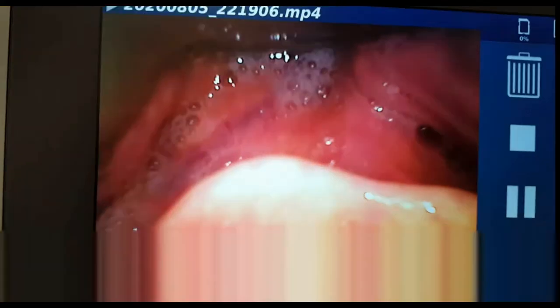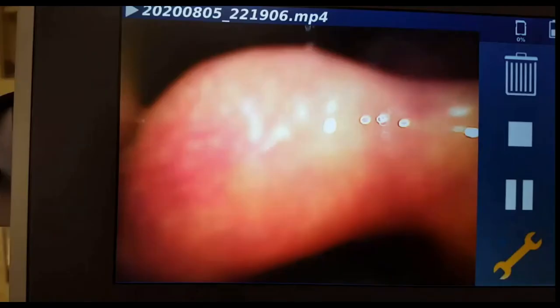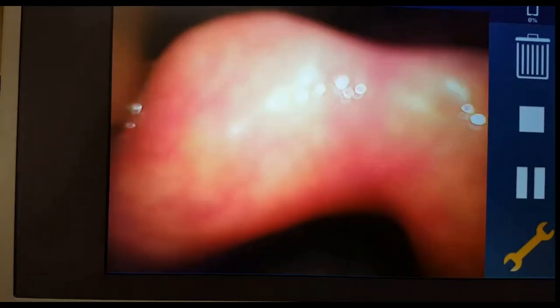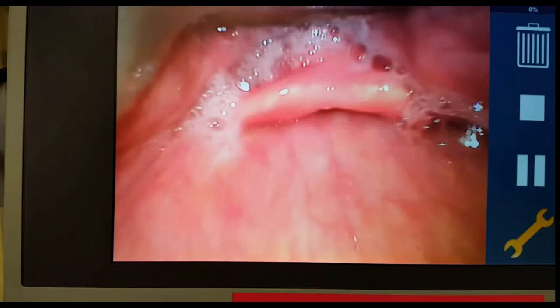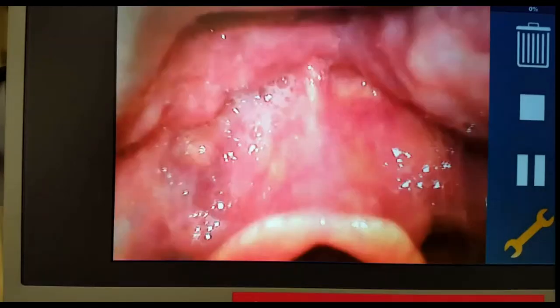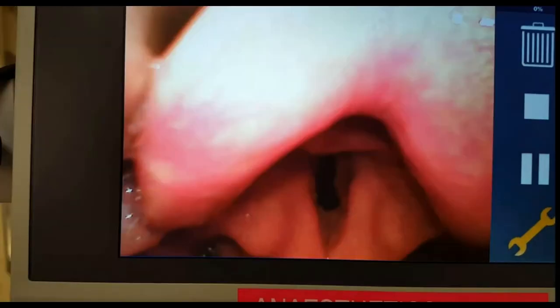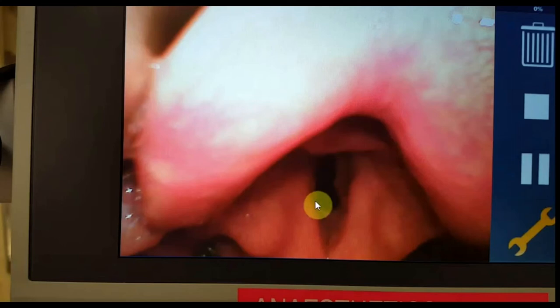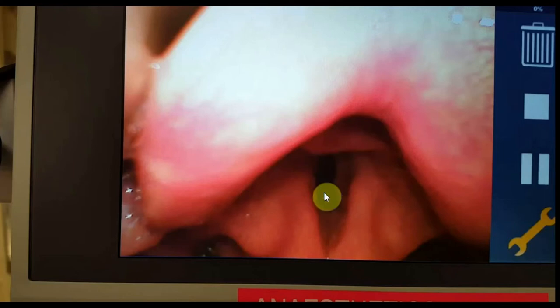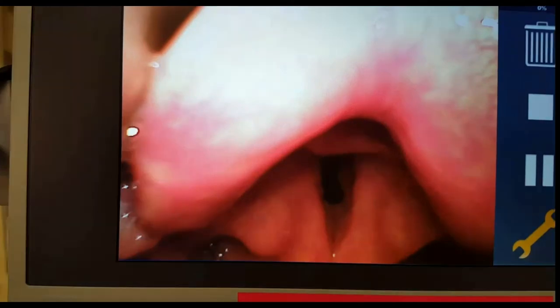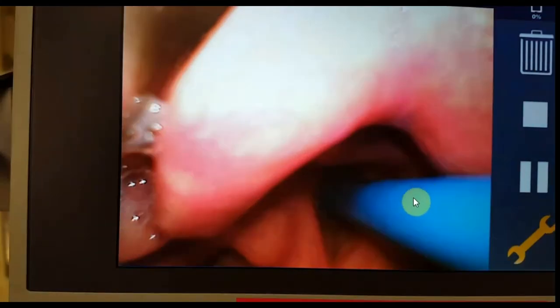Gradually we withdraw the video laryngoscope and now you can see a very beautiful view of the vocal cords. This is the right vocal cord — that is the patient's right — and that is the left vocal cord. We are passing the bougie through between the vocal cords.